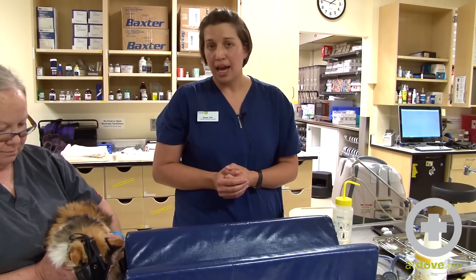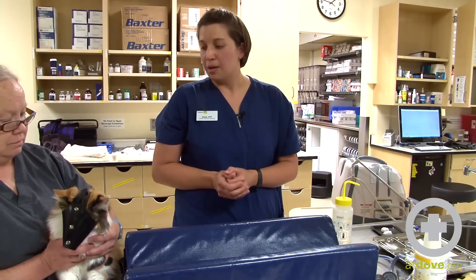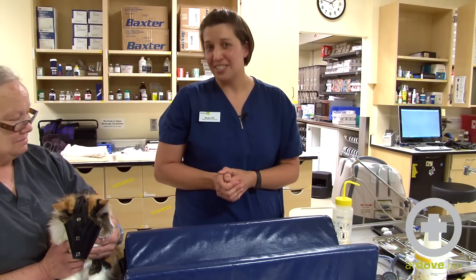Now that we've finished the procedure, we are going to let Morgan go back and relax in her cage. We do want to watch for vagal stimulation, which includes vocalization, dyspnea, and collapse. It is very rare but it is something to be prepared for, and that is how we do an ultrasound guided cystocentesis at Dove Lewis.